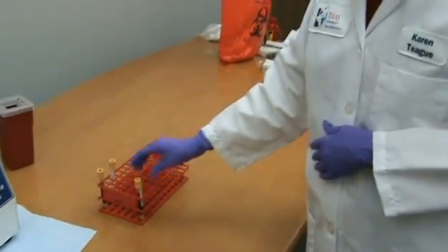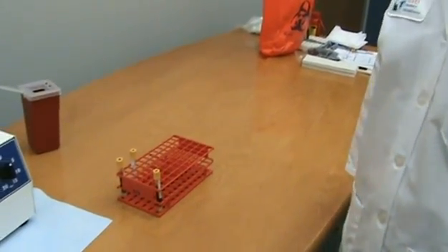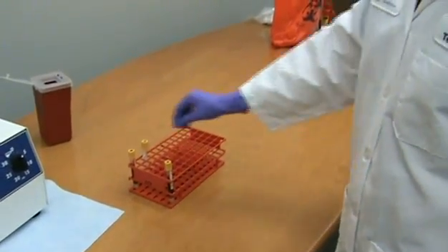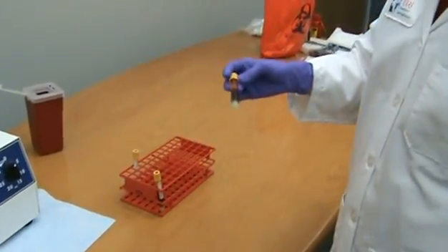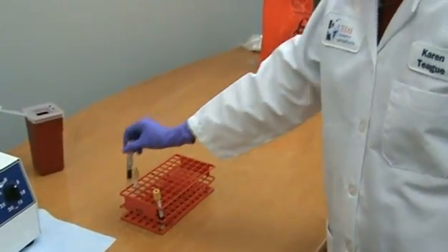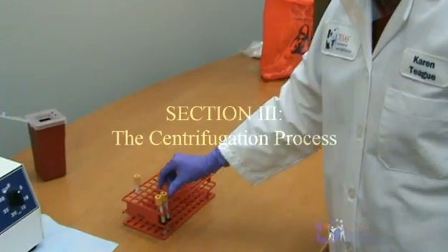Allow the specimens to sit at ambient temperature until a clot has formed. For most patients, clotting will occur in as little as ten minutes. However, the clotting process may require up to 60 minutes in red top tubes, while SSTs may require up to 30 minutes for clotting to occur.